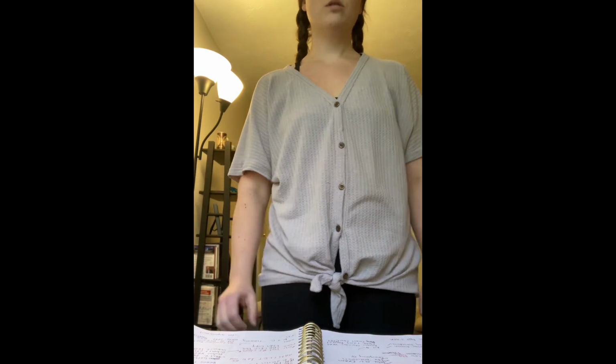The patient would still be standing, hopefully, if they can stand up, and we're still going to center the central ray to the coracoid process, but we're going to have them rest their palm against their thigh like this, and then the epicondyles will make a 45-degree angle to the plane of the film if they can rest their palm there. And that's for neutral rotation.